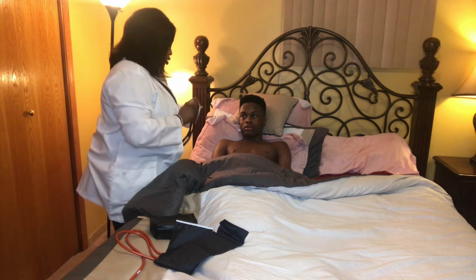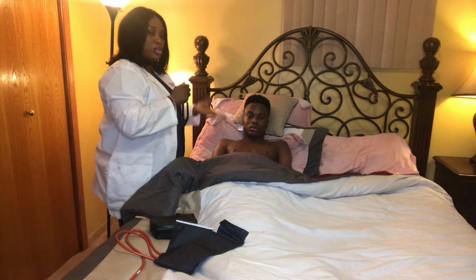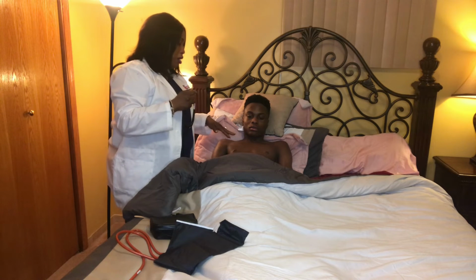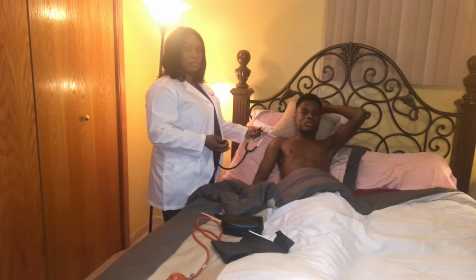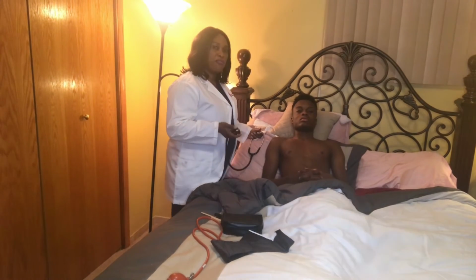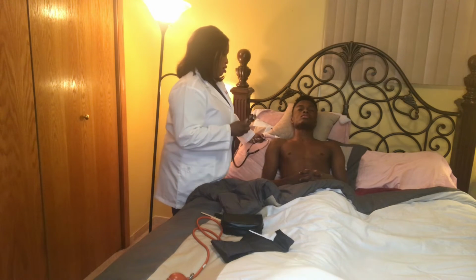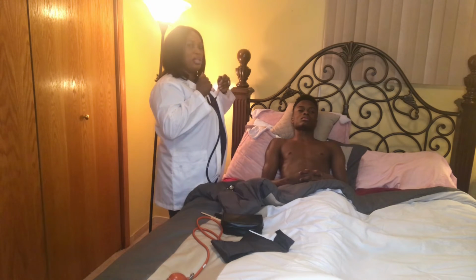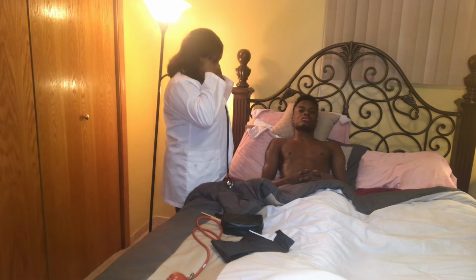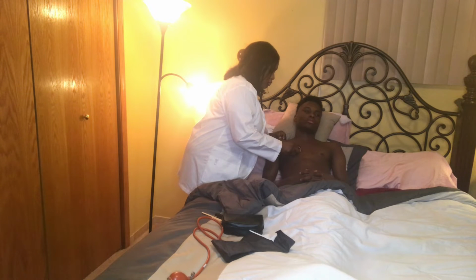All right. So now that I've just auscultated my patient's aorta, I'm checking on the S1 S2 sound on my patient, and for me to check the S1 S2, I need to listen to my patient's right second intercostal space, which will be the aorta.